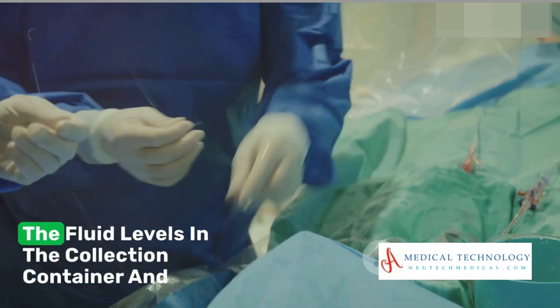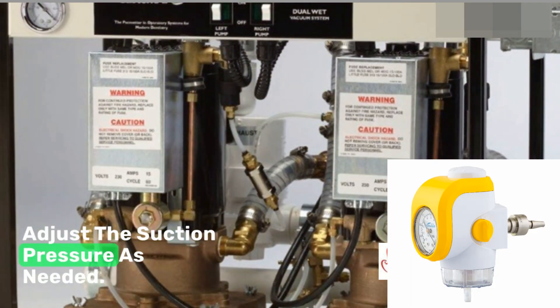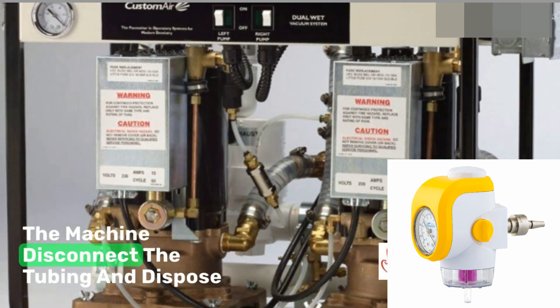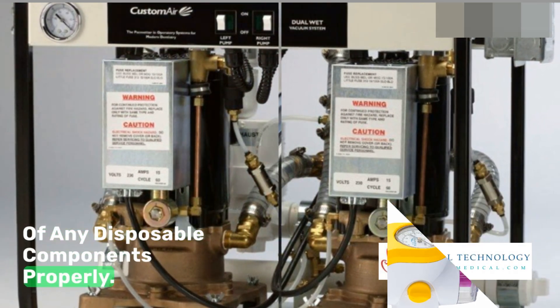Use controlled and intermittent suctioning to prevent damage to delicate tissues. As the procedure continues, it's crucial to monitor the fluid levels in the collection container and adjust the suction pressure as needed. Once the suctioning is complete, power off the machine, disconnect the tubing and dispose of any disposable components properly.